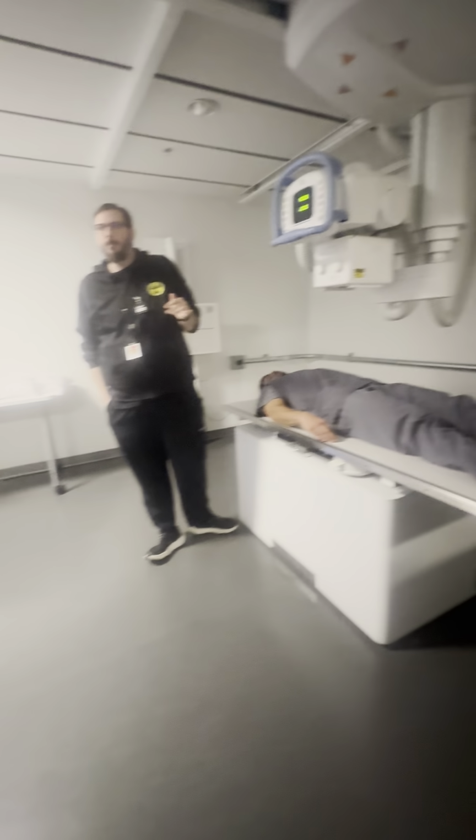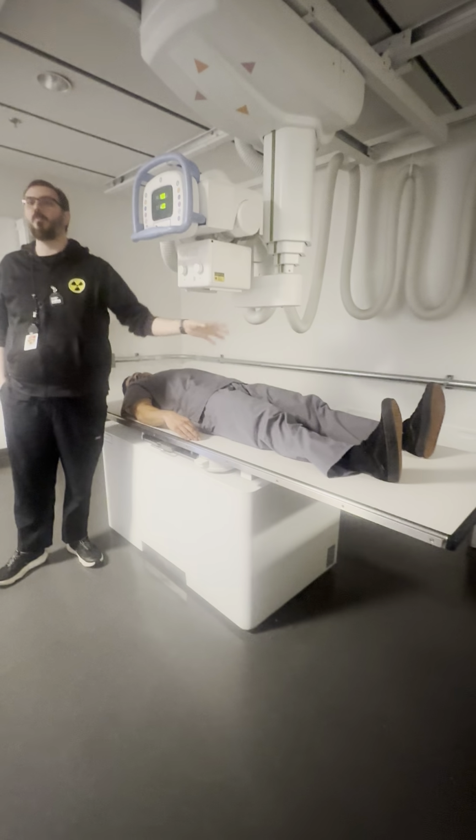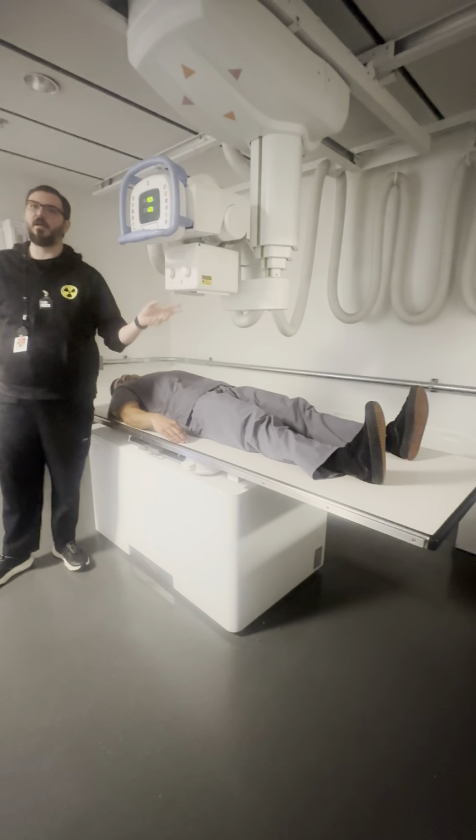Wait, so this is for the small bowel series? Small bowel series. You do initial, and I'll tell you, now show me your delay shot, and then I'll say, now show me either the axial UGI or the axial barium enema.